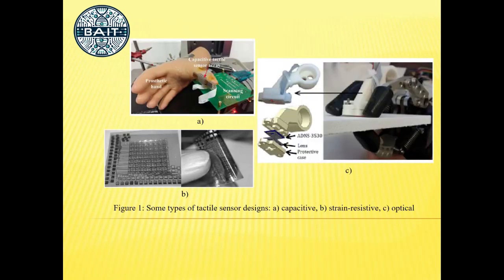Regarding the solution of the first problem, it involves the use of specialized sensors. In particular, the designs of resistive, capacitive, piezo, and optical sensors are known. This research presents the results of the development of a simple system for providing tactile sensations. Piezoelectric transducers are used as tactile sensors. As actuators for vibrotactile stimulation, it is also proposed to use piezoelectric transducers to create vibrations that will be perceived by the mechanoreceptors of the patient's stump skin surface.